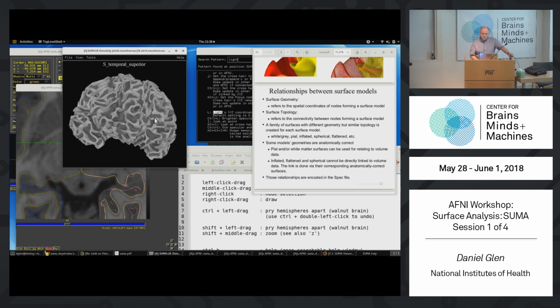If I would overlay two hemispheres just to compare, let's say, anatomical differences on the surface, is it possible to overlay two hemispheres? They're kind of mirror images, right? So there is a procedure to do something like this, and it's complicated.